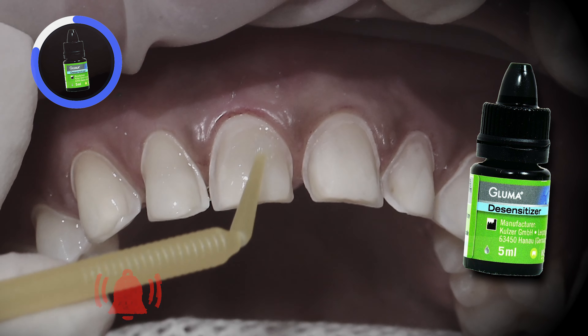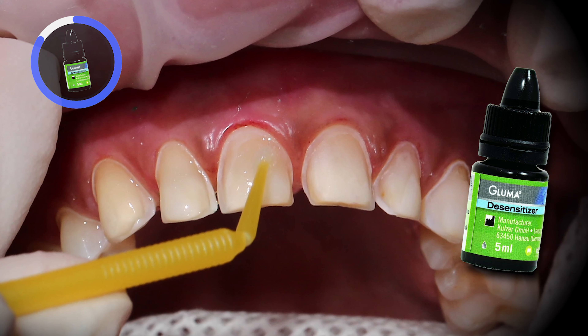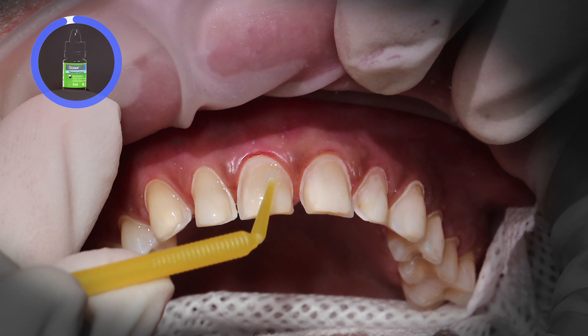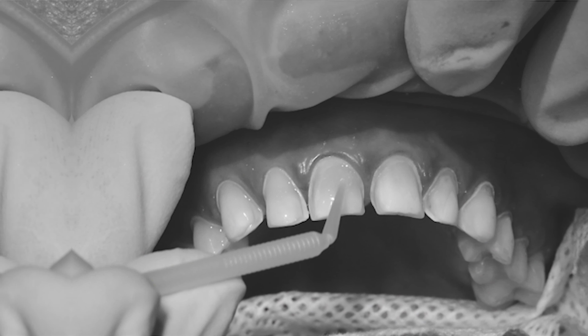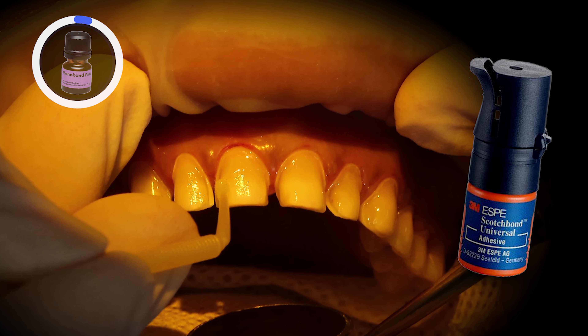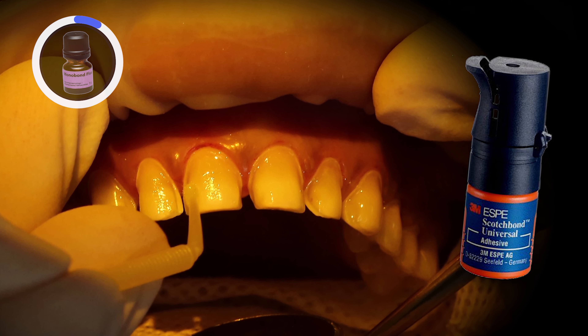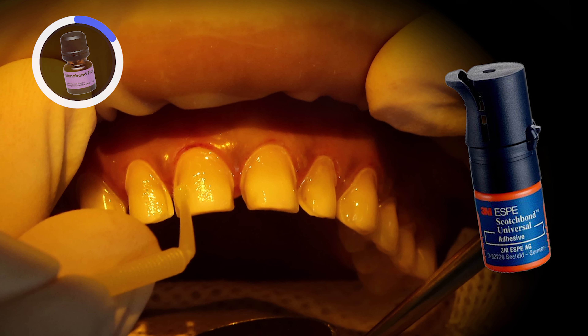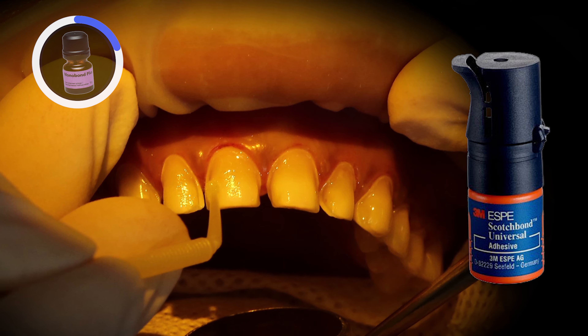Now it's time to try on the final Bruxer aesthetic veneers in place. Once the margins and contacts are verified, we can begin the bonding sequence. I use a total etch technique, first etching the preps with 37% phosphoric acid — etching numbers 11 through 13, followed by 7 through 10, and then 4 through 6 — breaking them apart to ensure we aren't over-etching any teeth.